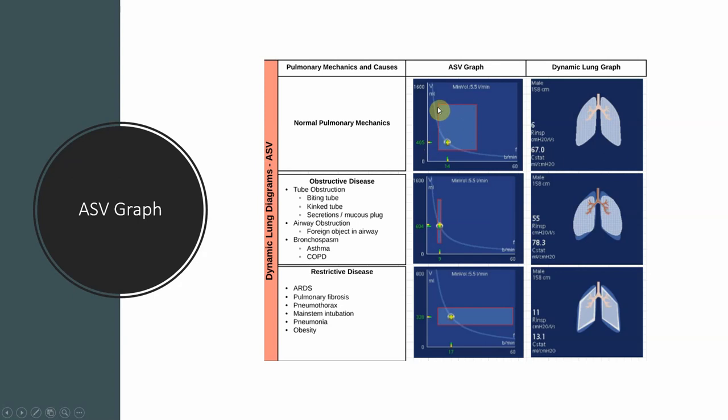If you have a patient with obstructive disease, this bronchial tree turns red. The lungs actually can inflate outside of that lung shadow a little bit. But look what happens to your ASV graph. So it allows a higher tidal volume because the lungs are kind of floppy. They're compliant, but they're more floppy than compliant. But the rate narrows. The rate narrows because it realizes, although I have compliant lungs, it takes a long time for that patient to exhale. So I need to limit the rate and give a higher breath.